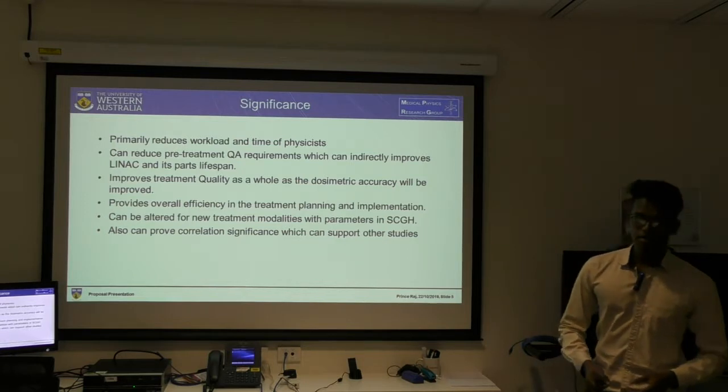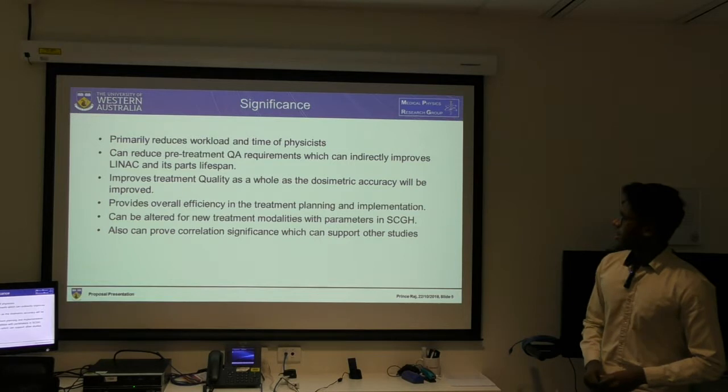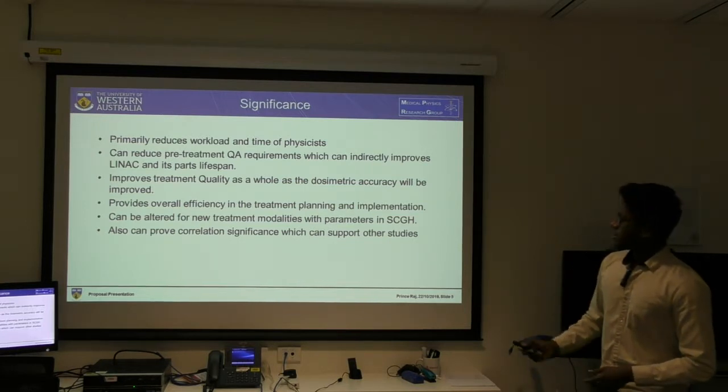That is a possibility. It's not compulsory, but it's a possibility. That will reduce the QA requirements, and it also increases the LINAC lifespan, because every time the LINAC is operating, it is using up its life.